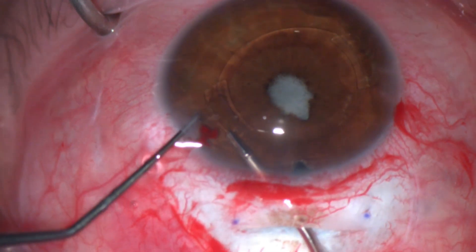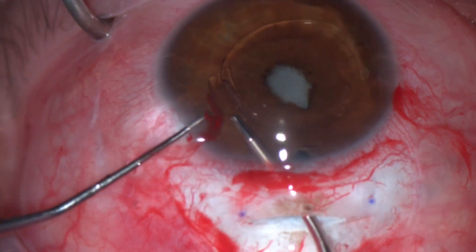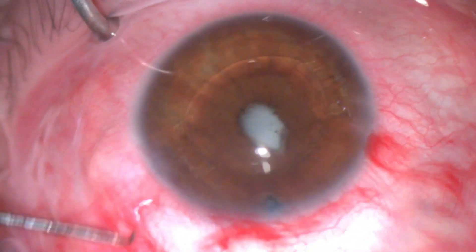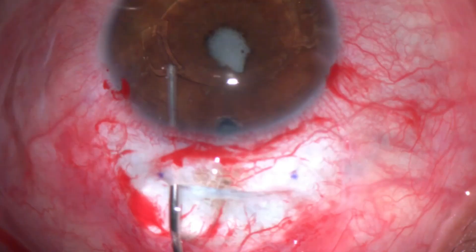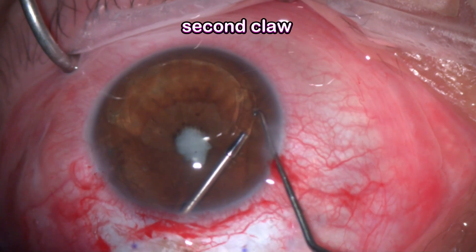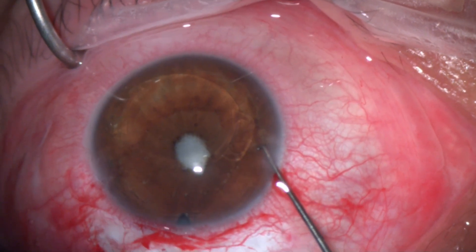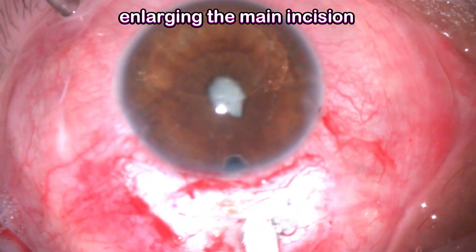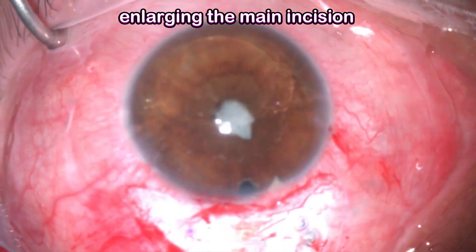One micro forceps grips the claw of the lens, and a second instrument disengages the claw from the iris. The main thing here is to try to be as atraumatic as possible. We repeat the same process for removing the second claw, and once the lens is freed from the pupil we can enlarge the main incision.